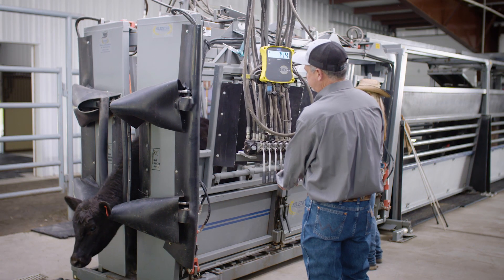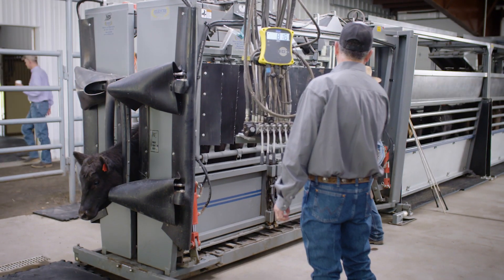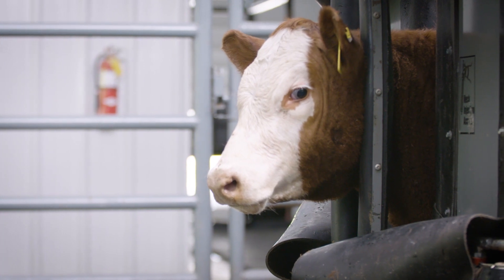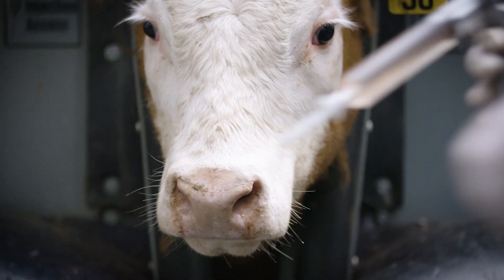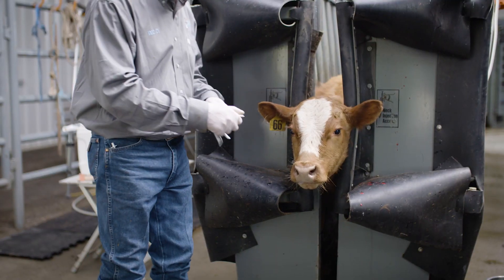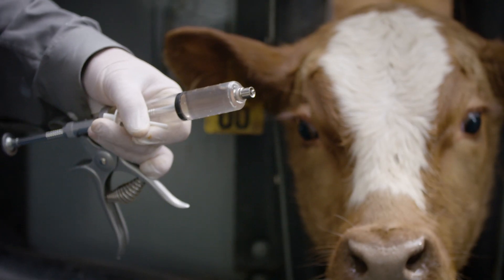Enforce 3 is an intranasal vaccine. Properly restraining the animal's head and neck is key to successful administration. For larger cattle, it is important that the animal is first properly restrained in a headgate or chute. Use the cannula or pump-it device to give the animal 2 milliliters of Enforce 3 in a single nostril.